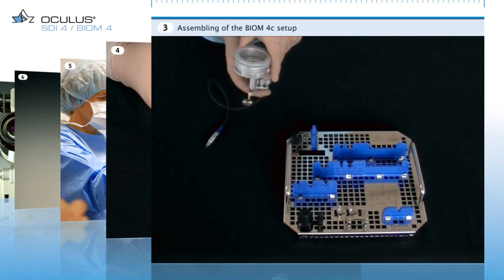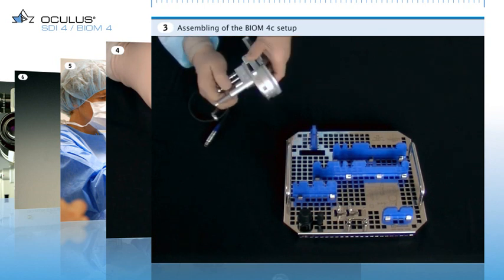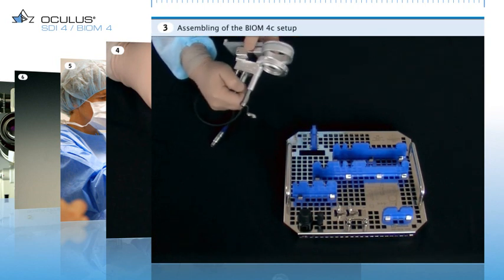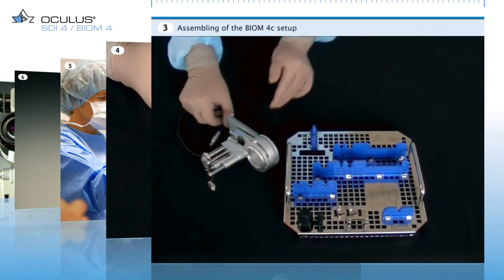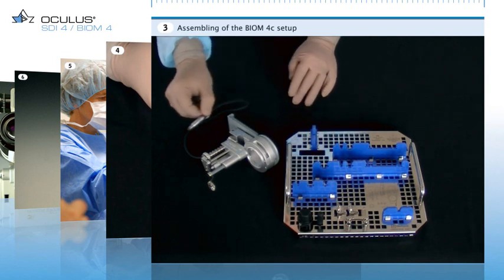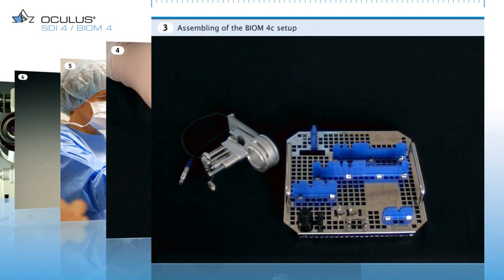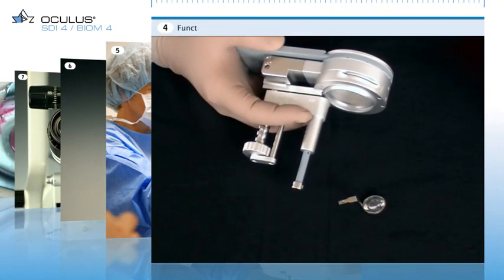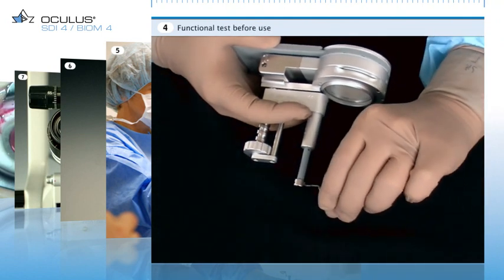A safety check must be performed before every use. This includes checking that the lens holder runs smoothly. Then swing out the adapter by 90 degrees and also check its return travel. To enable powered control, plug the cable plug into one of the couplers on the SDI-4C housing. Here you see a close-up of how the front lens is assembled and the lens holder is checked for smooth movement.